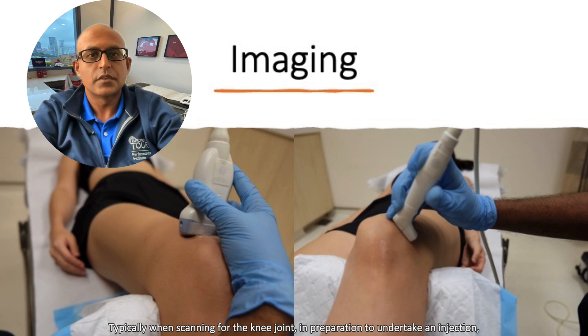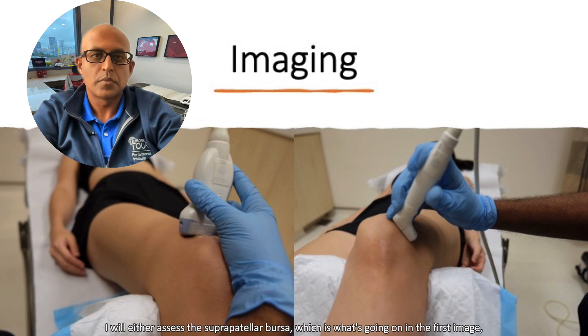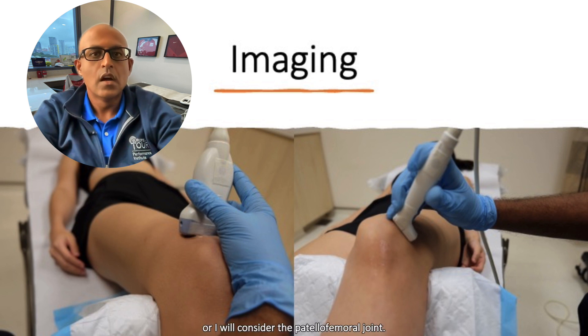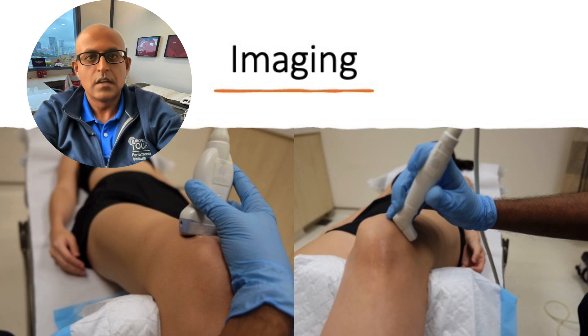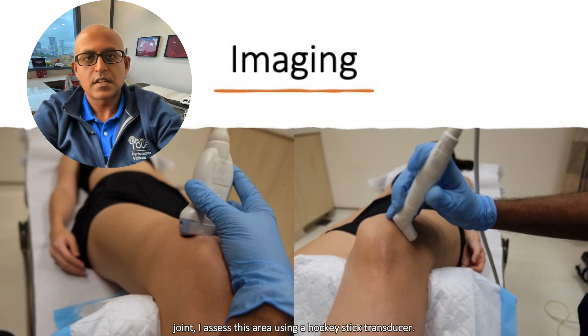Typically, when scanning for the knee joint in preparation to undertake an injection, I will either assess the suprapatellar bursa, which is what's going on in the first image, or I will consider the patellofemoral joint. With the first part, I typically use a linear transducer, whereas when scanning the patellofemoral joint, I'll assess this area using a hockey stick transducer.